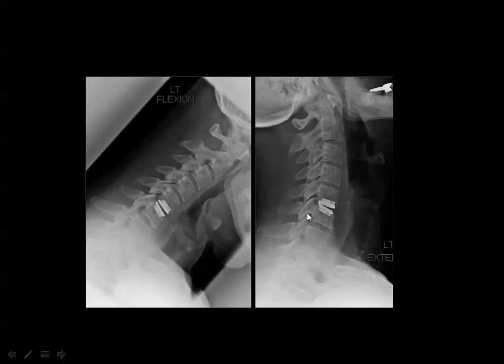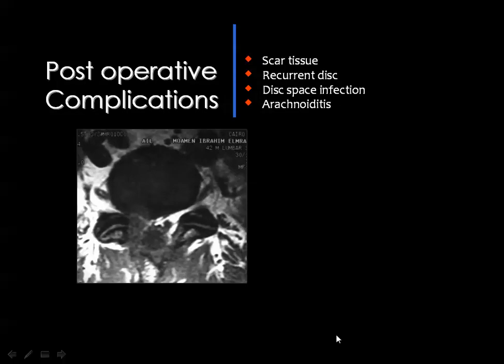They tried here to make the prosthesis able to move, to simulate the original disc, because you know that if you have fixed this level, there is a great opportunity to have a disc lesion above the fixed level or below the fixed level. Then they tried to have a disc spacer which can allow some movement at the level of surgery, so that you can prevent the development of disc lesions above or below the level of surgery.